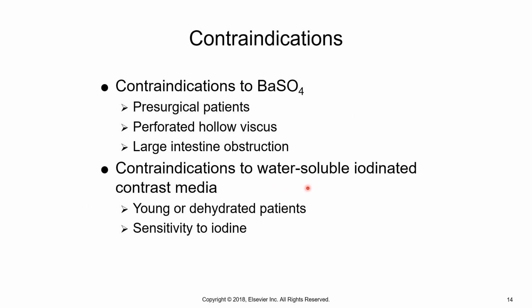Contraindications to the water-soluble iodinated contrast media, typically they will not give that to very young or dehydrated patients because it tends to increase the dehydration, and they cannot give that to patients that have a sensitivity to iodine. If they have a severe allergic reaction to the iodine, then the patient could not be given the water-soluble iodinated contrast. So those are contraindications.